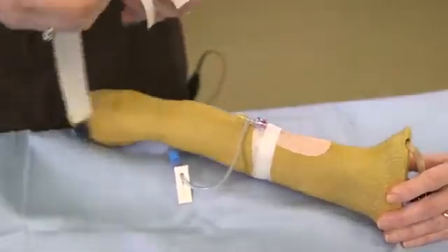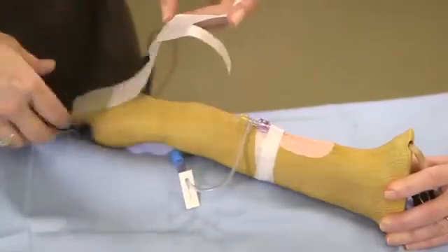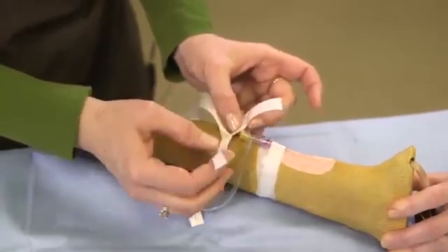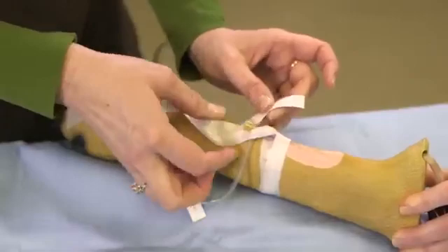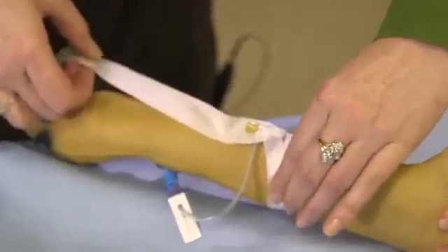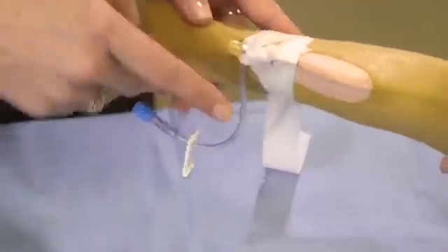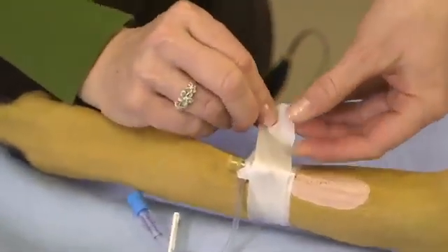Lastly, we have what some of us call the Y piece of tape. It's a regular, unripped portion except for the very top. Go under the port here. You have this extension of the T-port. You take one piece, go over that, and crisscross on top of the catheter. This side comes over this portion of the catheter, secure down, and pull this tape in the direction away from this port so it's nice and snug around there. And you go around your catheter and you leave a little tab on this side.